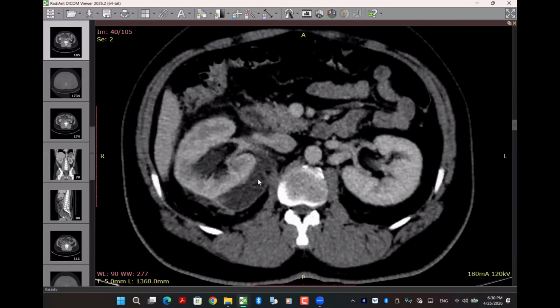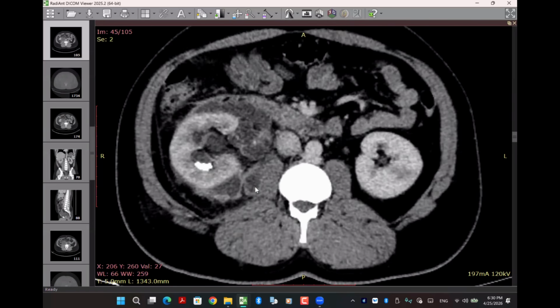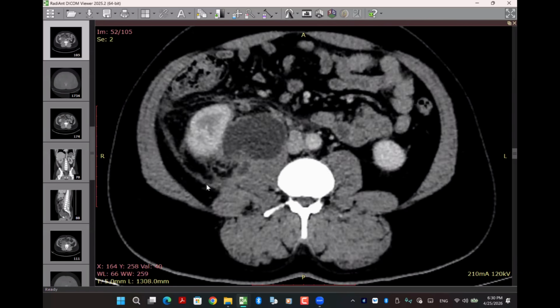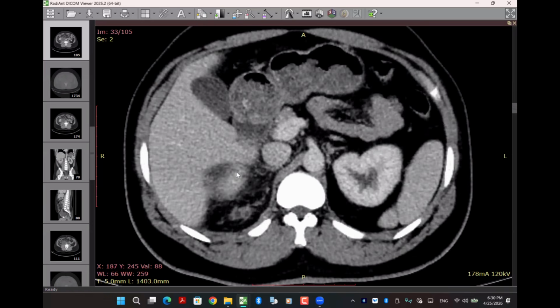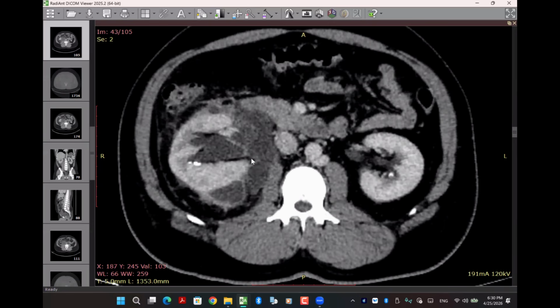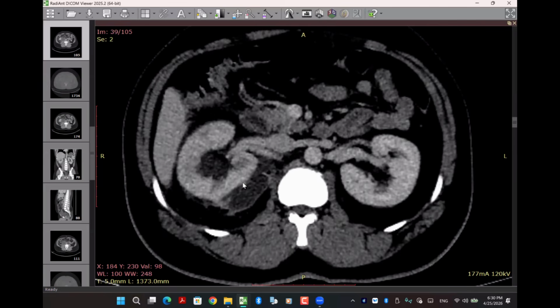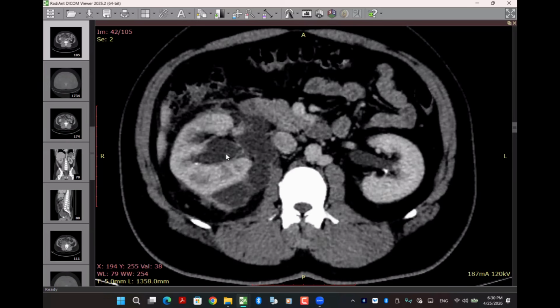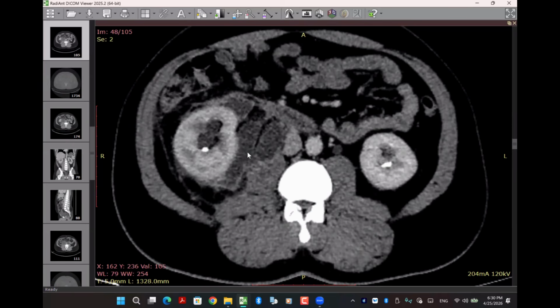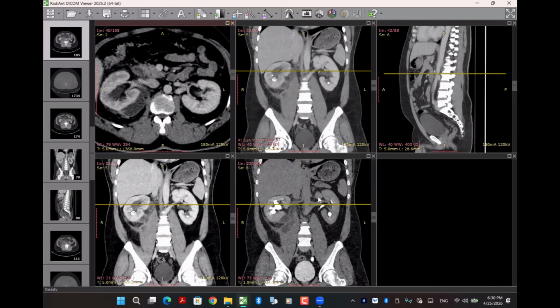He needs a specific answer to specific questions. Is that a urinoma, yes or no? Is that compromising the kidney function? Is there associated renal involvement by this inflammatory process or collection, yes or no? And is there any calyceal rupture on the delayed image? You got my point?